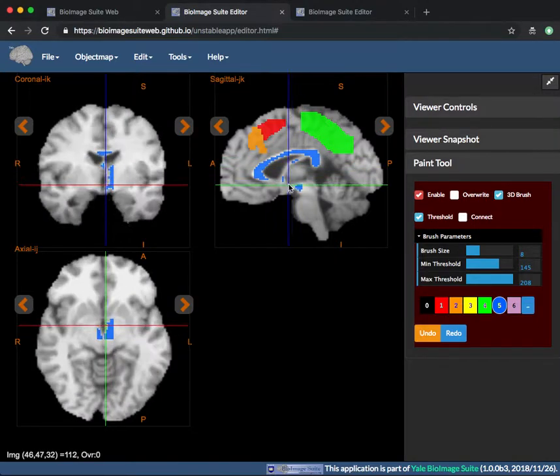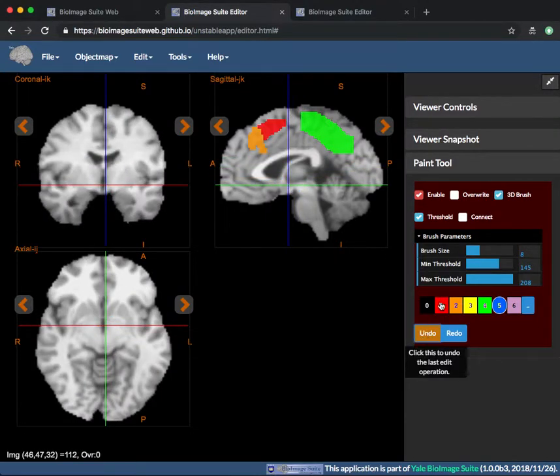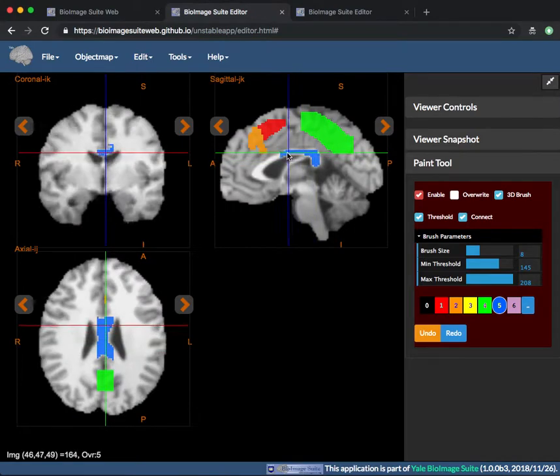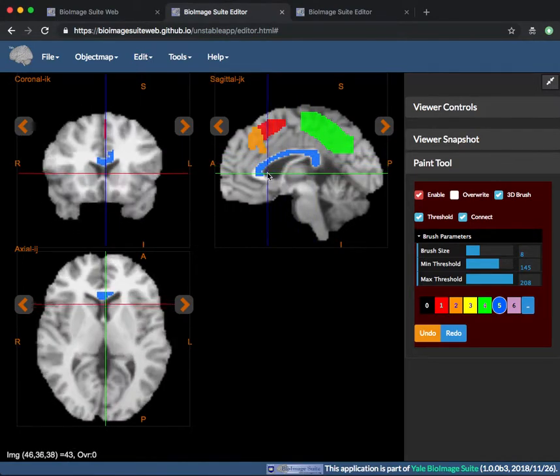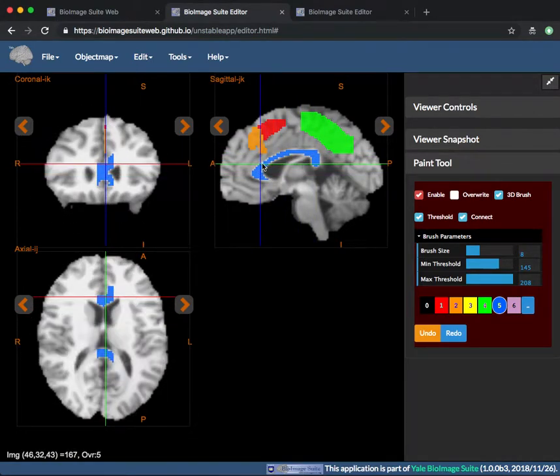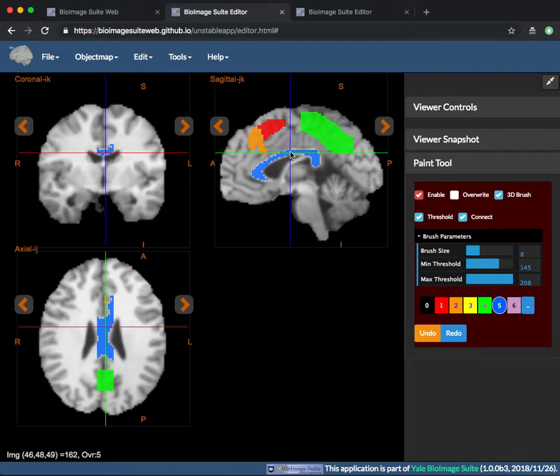Finally, connect. If this and threshold are both checked, Paint Brush only fills in voxels between the thresholds that are also connected to the central voxel.